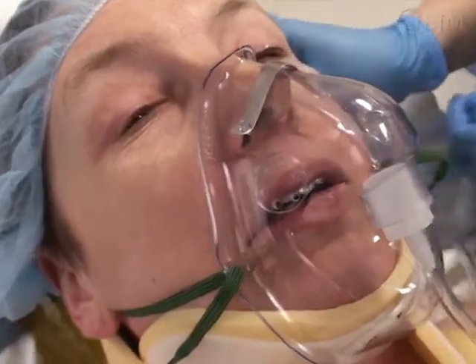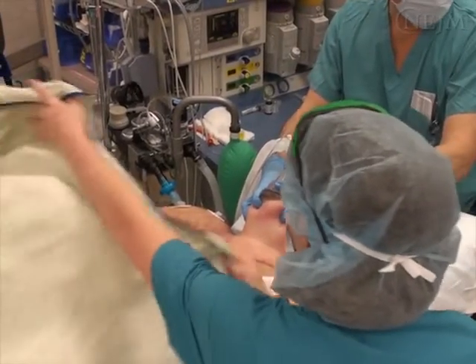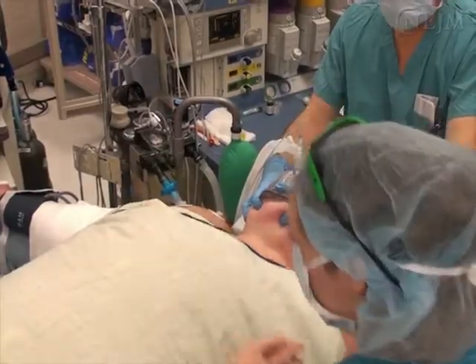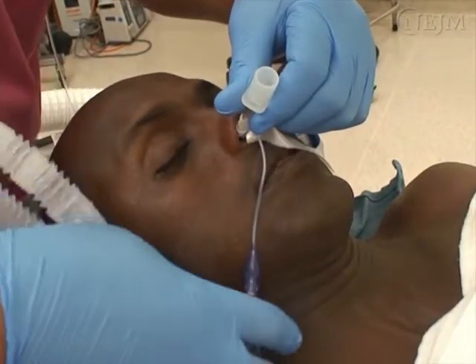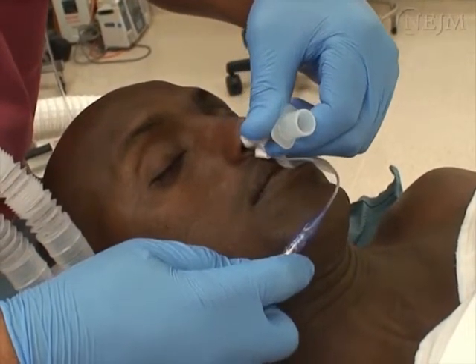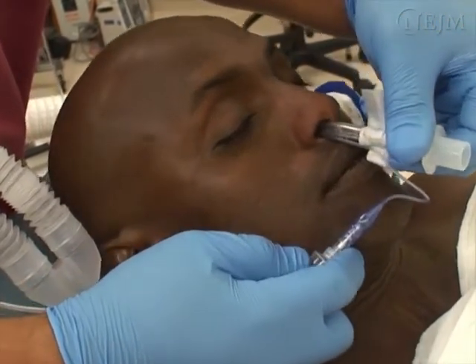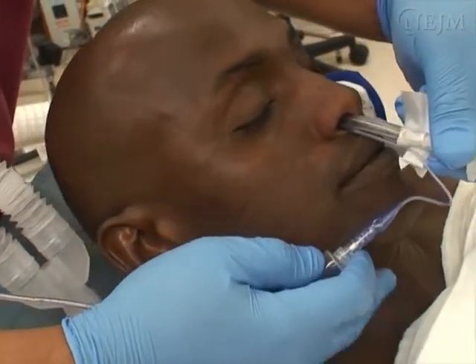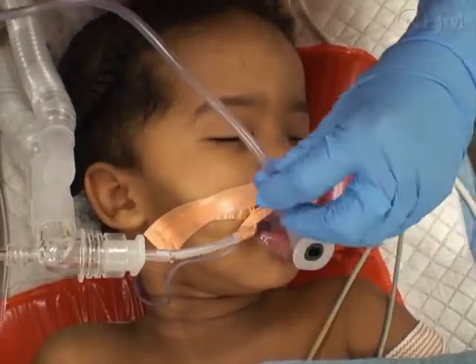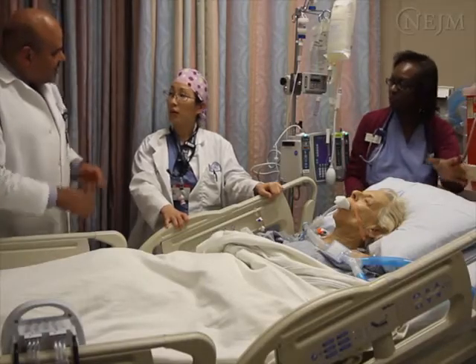Continue to provide supplemental oxygen through the face mask until the patient has fully recovered. In the next segments of the video, we will limit our discussion to extubation of morbidly obese patients and difficult extubation. There are many other clinical situations in which endotracheal extubation can take place that are not discussed here, for example, nasal extubation, pediatric extubation, and extubation following prolonged intubation.